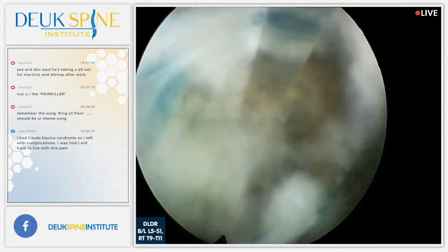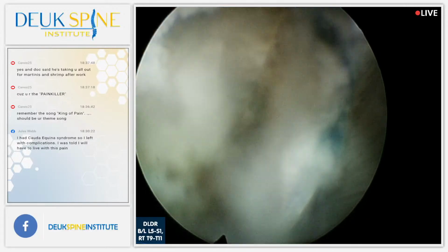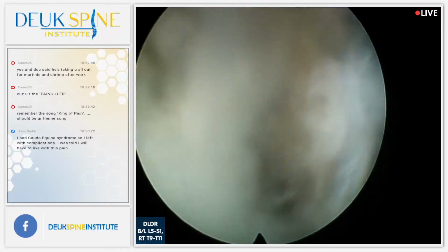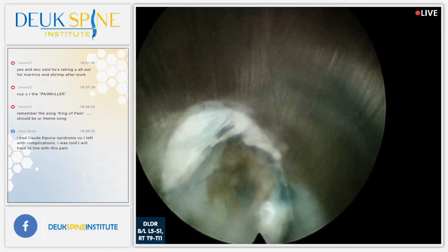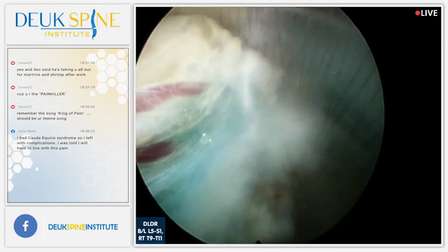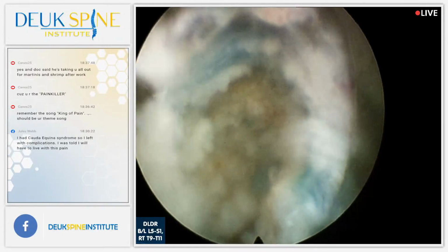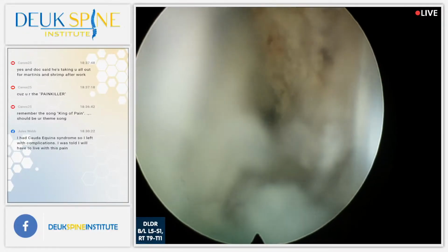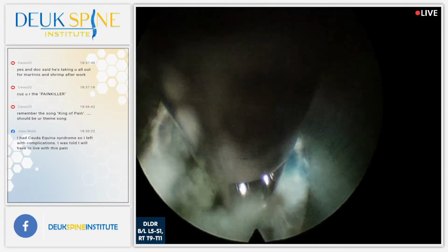Pretty good. All right, we're just about done. One more minute. This is 5-1, remember? And so far it's gone well. Let's see if we can see the nerve root. There's the nerve up there in the fat. You see the veins around it? Looks great. I'll try one more grab and we're done. And then we need to irrigate, move on.